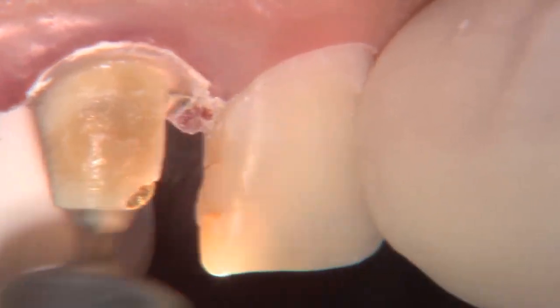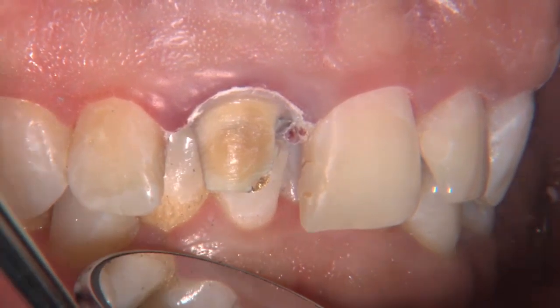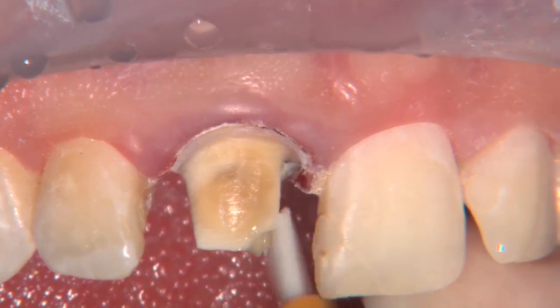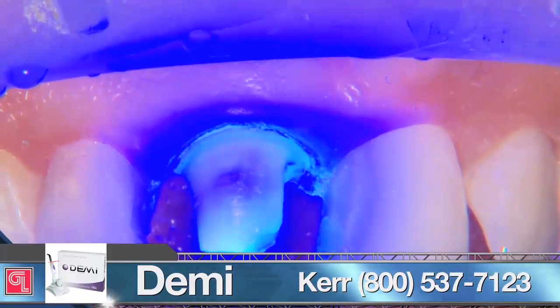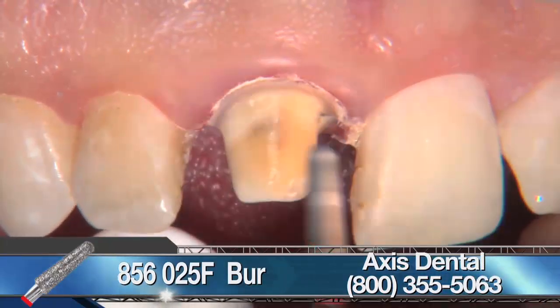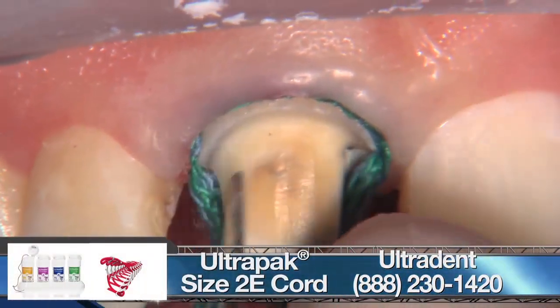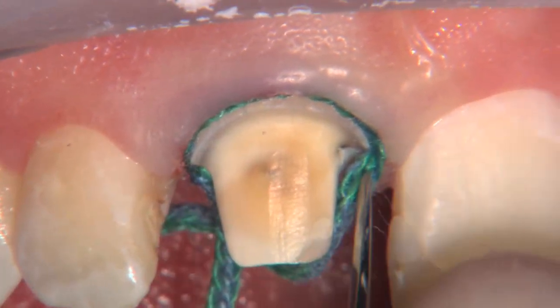I must have brushed that burr against the gingiva and that's why we've got a little bleeding. We're going to use the Viscostat Clear from Ultradent — that's always my first choice for an astringent in the anterior because we don't get any discoloration of the gingiva. If that doesn't work, we move on to ferric sulfate, which works even better but will cause some discoloration. I've exposed a little bit of gold, so I'm covering this up with Vertis Flow from Kerr — a self-etching composite resin. I agitate it with a brush for about 15 seconds, cure it, and add a little more composite. No need to etch or use a separate bonding agent. I'm then smoothing the prep with an 856025 burr — same shape as the coarse burr, just much smoother, getting rid of chips in the margin. The top cord is a 2E cord, Ultrapack cord from Ultradent.